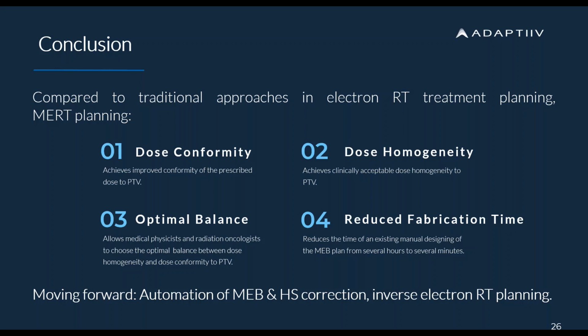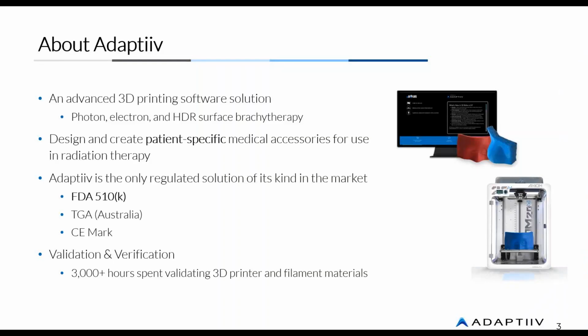Yes. And for the electron, so the answer is that modulated electron bolus is only one of the modules we have in our software. The other modules are simple bolus module and surface brachytherapy module. So just briefly, simple bolus module takes your bolus that's been created in the TPS and gives you, as the outcome, an STL file which can be 3D printed and put on a patient.